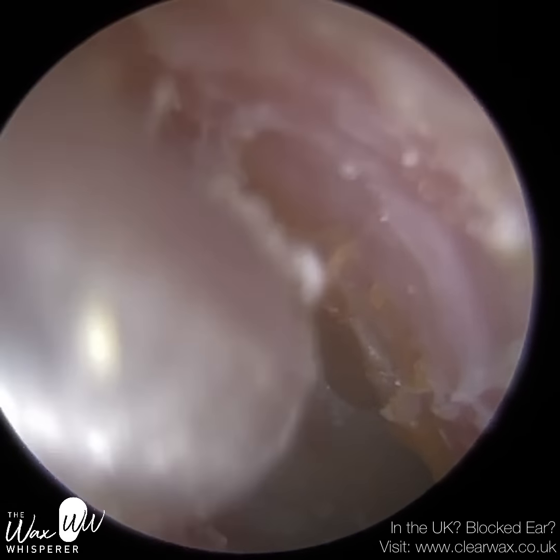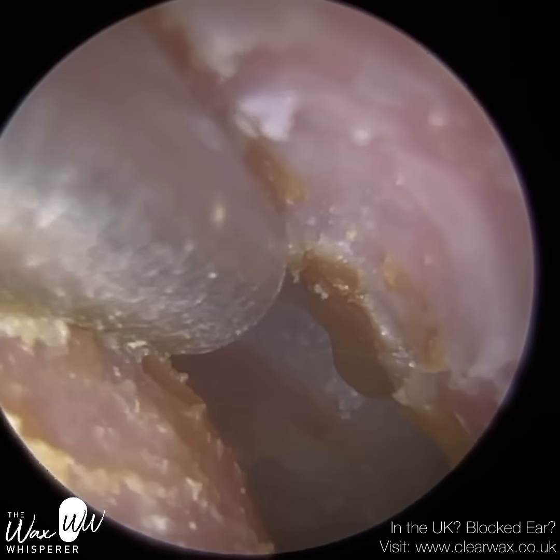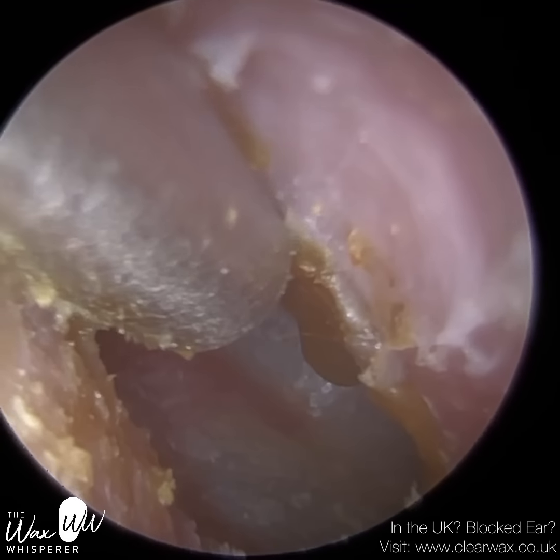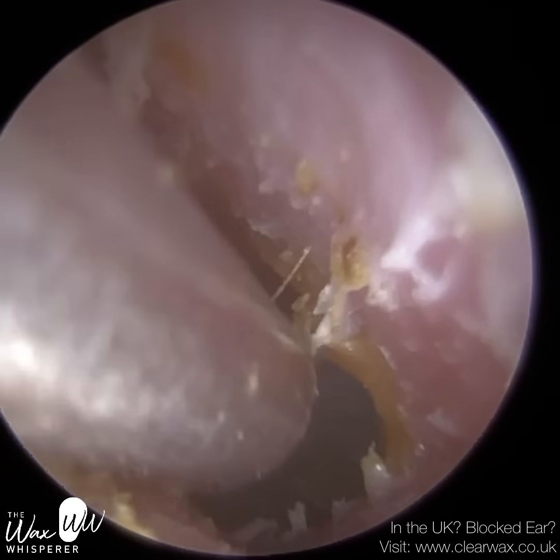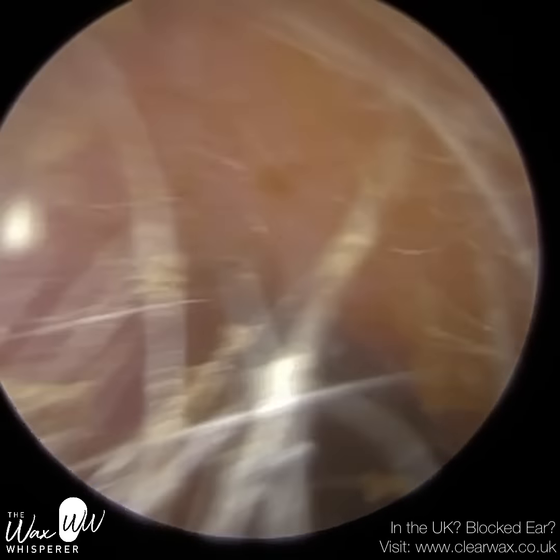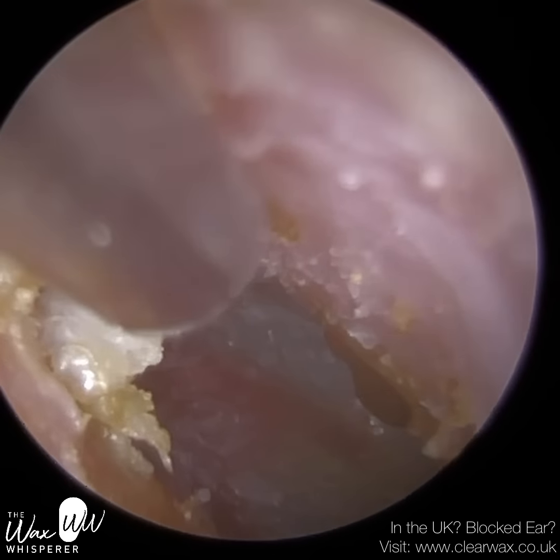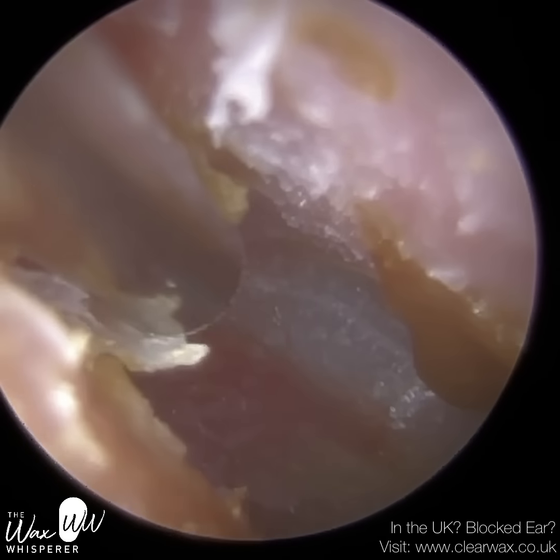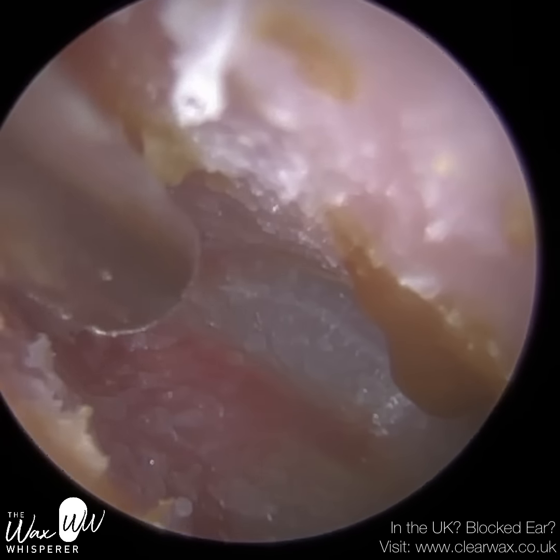I just want to spend a bit of time now trying to suction this dead wilted skin. We're not going to get every last speck, it's just not possible, but I want to get as much out as I can, as comfortably as I can for the patient. And I'm going to revert to a fine end suction probe now, I believe. So we're just at the roof of the ear canal, and I'm just peeling this downwards.